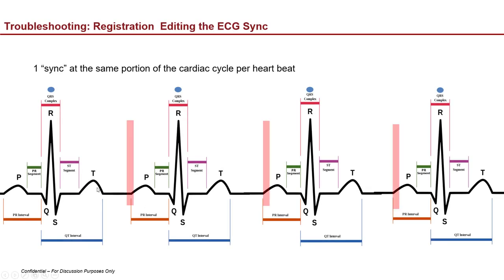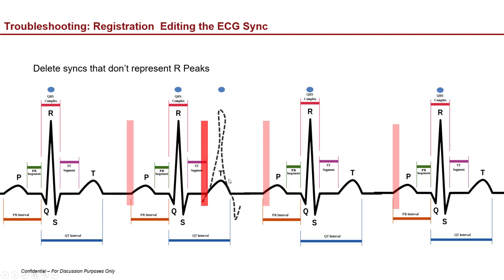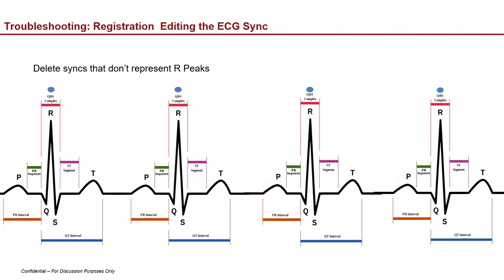Now let's troubleshoot how to register and edit the ECG. We have blue balls over our R peaks called syncs. Every CT scanner with a cardiac mode allows you to define your R peak with a sync. You'll want to delete syncs that don't represent your R peak — for example, if you have a really noisy ECG signal and that's not a real R peak, you right-click and delete it. Your reconstructions can then come from the same place based on actual heartbeats.